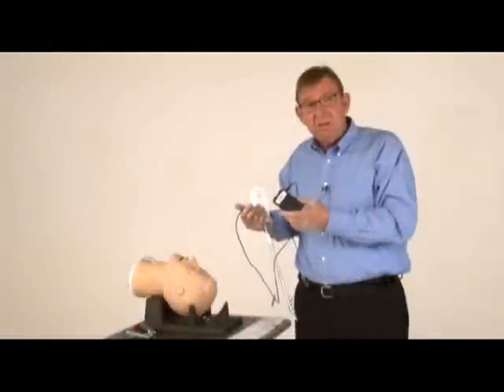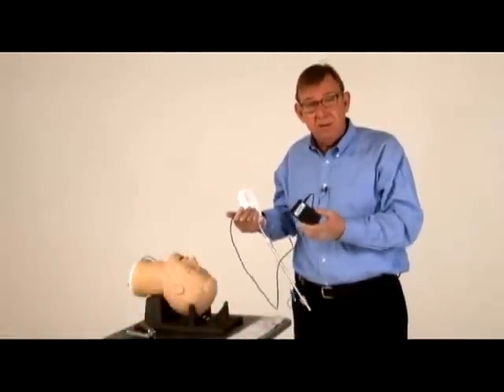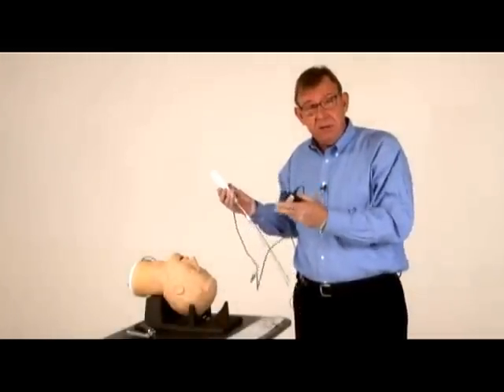The PIC-Stick DVR is a solid-state digital video recorder and an option for the ViewStick. It will also work with many other common video laryngoscopes. You just plug it into your ViewStick handpiece and push the clip button when you begin the intubation. When you've finished, push the clip button again. If you forget, it will automatically shut off in two minutes.